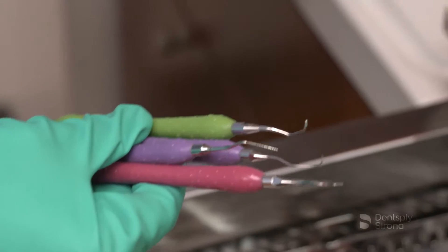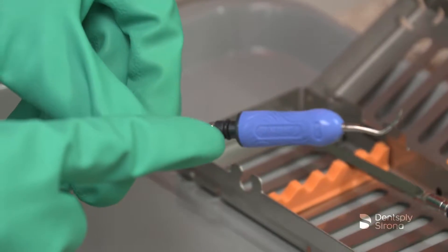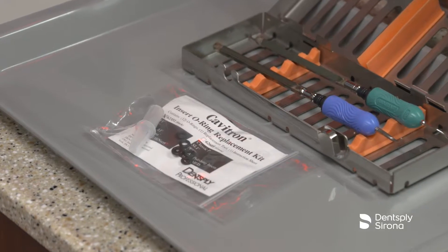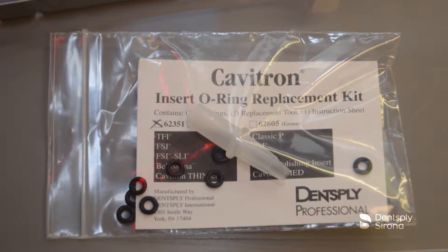Visually inspect instruments to ensure all contamination is removed. Repeat cleaning steps if debris is remaining. It is important to visually inspect the O-rings of the Cavitron inserts for wear. If O-rings are showing signs of breakdown or wear, utilize the Cavitron O-ring replacement kit to change the worn O-ring.